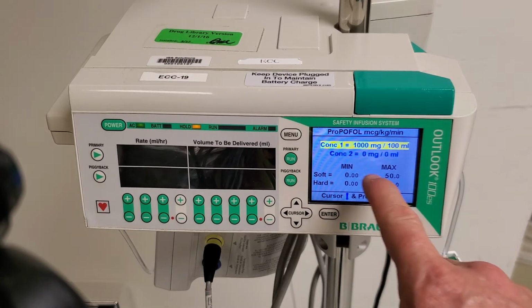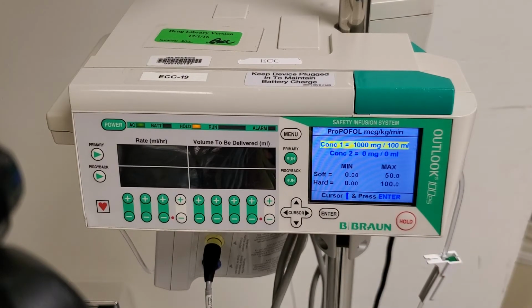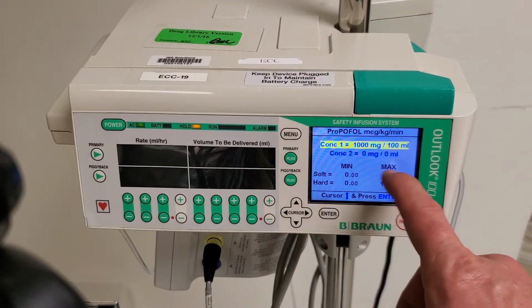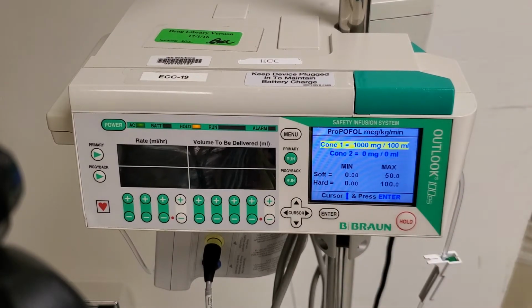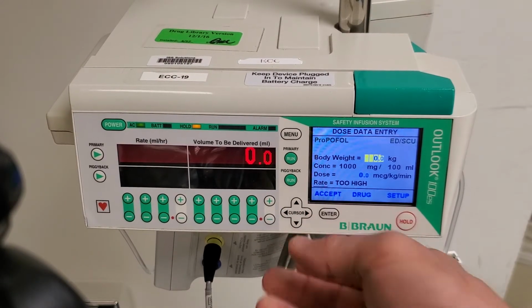Notice that there, in the dose guard selection, notice that there are hard and soft maximums and minimums that you can administer. And I'll show you, there's a graph on the next screens that better depict what that does. So we'll use the standard concentration.